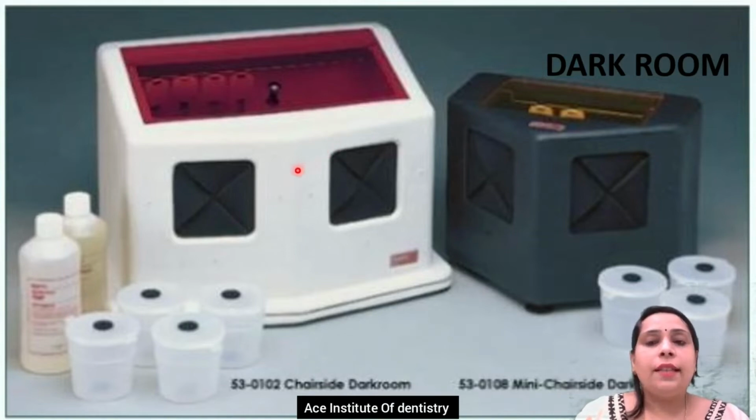Everyone has their own method of arrangement, but the standard method is that first we have two bottles, one is developer and the other is fixer. In between we have to place the water. Usually in our premises it will be written as D. D means developer, W means water, and F means fixer. So inside you'll be having three bottles.